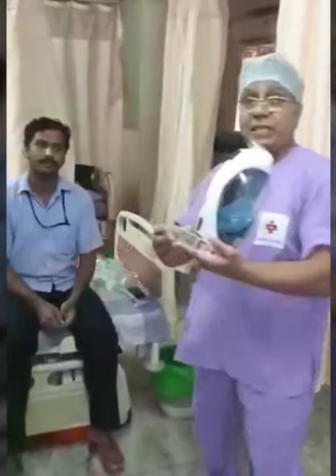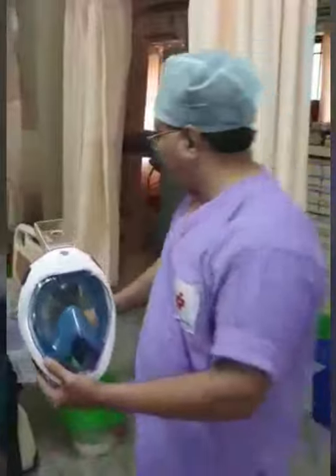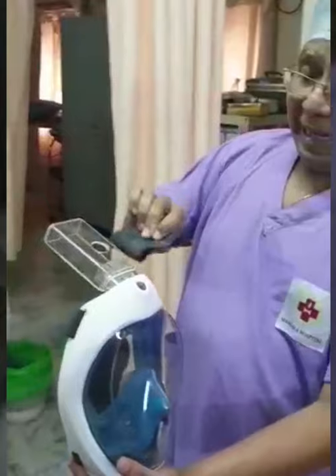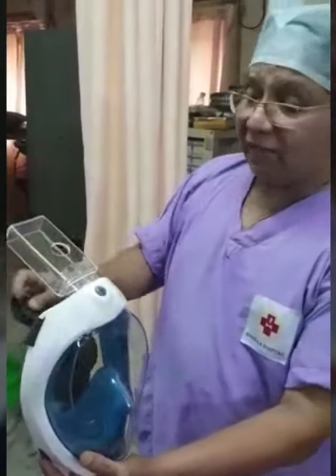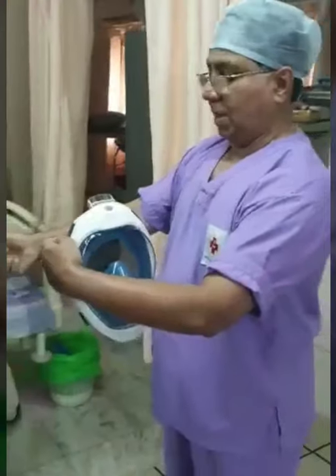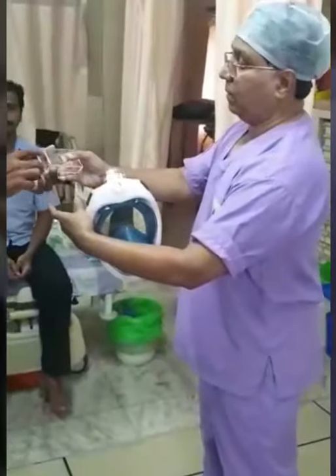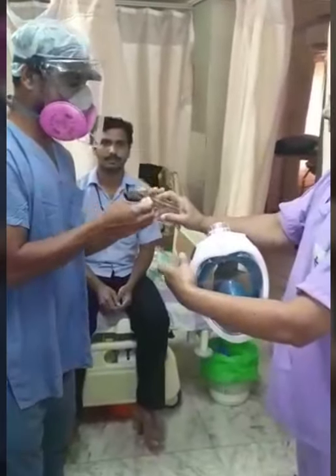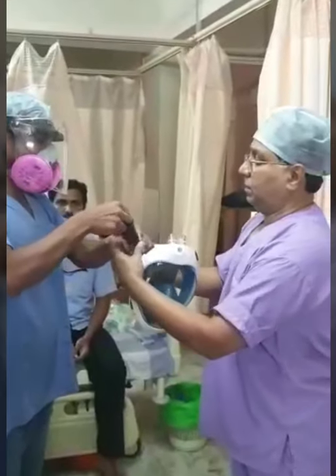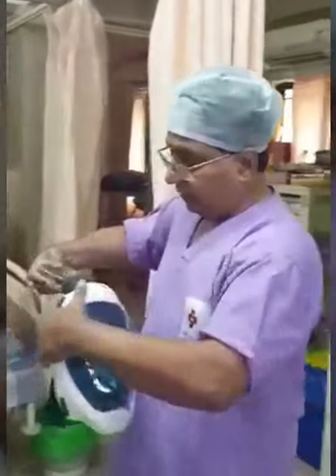Now, I will explain how to use a single port connector. You take the connector and attach it here. There is a rubber washer that we provide. This can be fixed here in case there are any signs of leak. The rubber washer is slipped onto it, and then the connector goes in tightly.